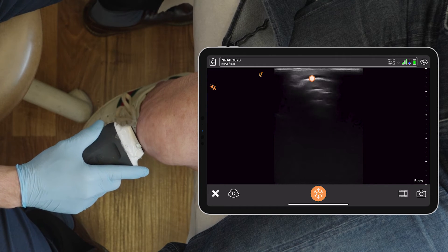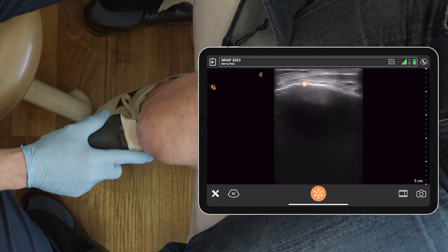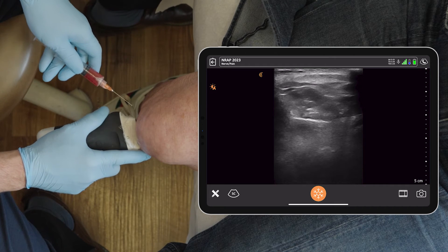We can see the patella really superficial right here. Scanning a little lower, this is the joint space — here's the tibia — and we are right between them. I'm going to perform the injection from a lateral aspect.